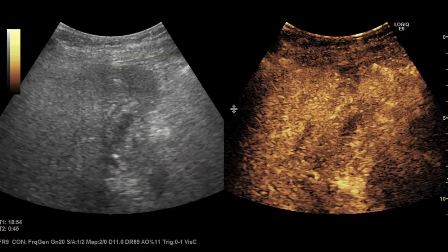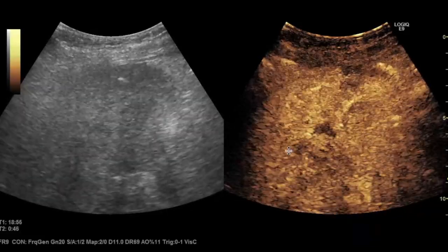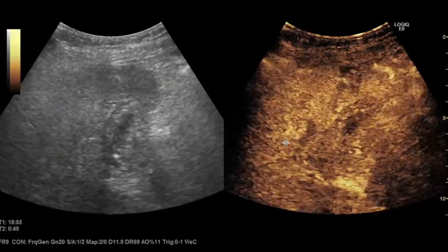We ended up targeting, you can see our FNA needle going through the more peripheral one, as that one seemed easier to perform, and this ended up being cholangiocarcinoma.